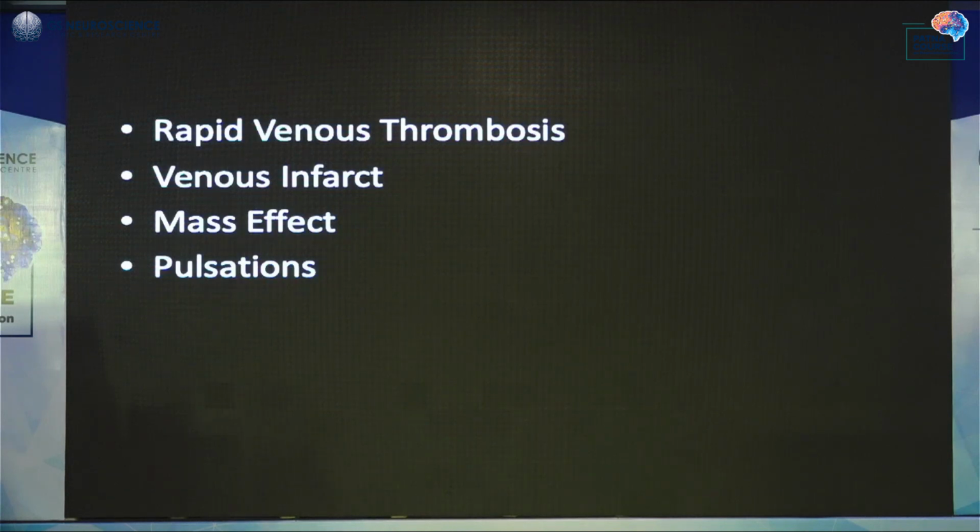If you have not gotten satisfactory results from embolization, it means that there is some other pedicle which is still filling it. Just a theoretical question, sir. Supposing we make this a hybrid procedure, because we do not know how much of the nidus or fistula tract we are embolizing, and we always say these cases need to be followed up for recurrence. So if we are theoretically going in and embolizing this with a glue or an embolic material that becomes radio opaque.